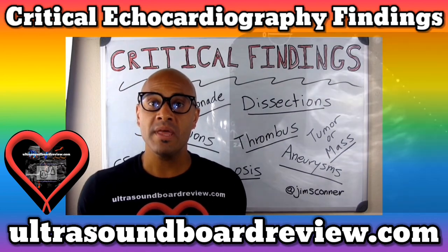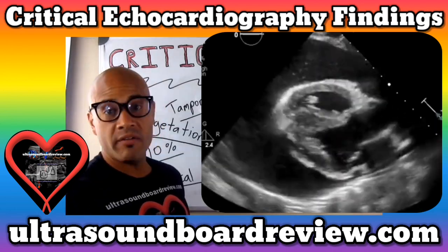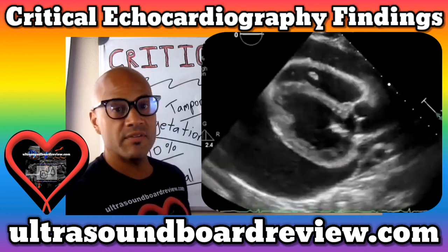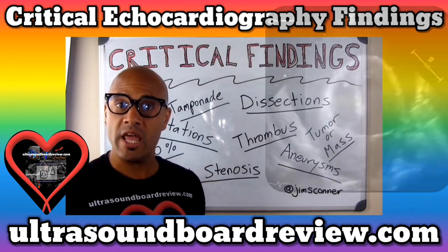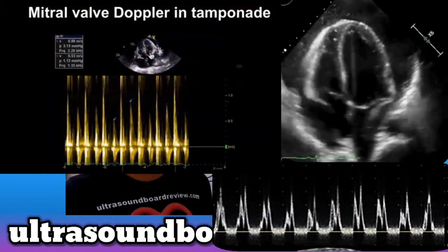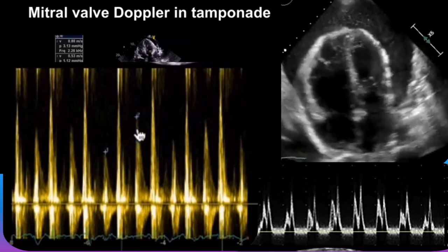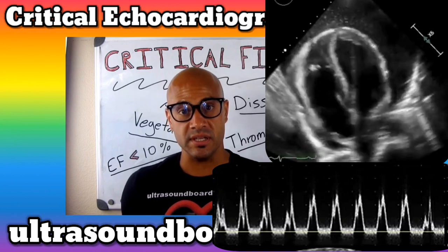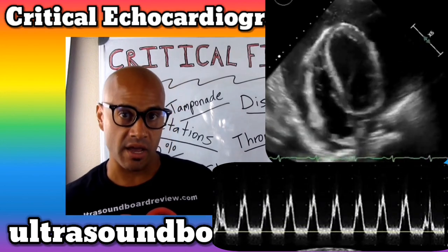In this next echo, a patient came into the emergency room complaining of chest pain and shortness of breath. Right off the bat, you can tell something's abnormal. If the heart is swinging like that, you should automatically think tamponade. The first thing you should do is go to the apical four chamber view and run Doppler through the tricuspid and mitral valves — use pulse wave and continuous wave. You're looking for greater than 25% variation in the tricuspid and mitral valve during inspiration and expiration.